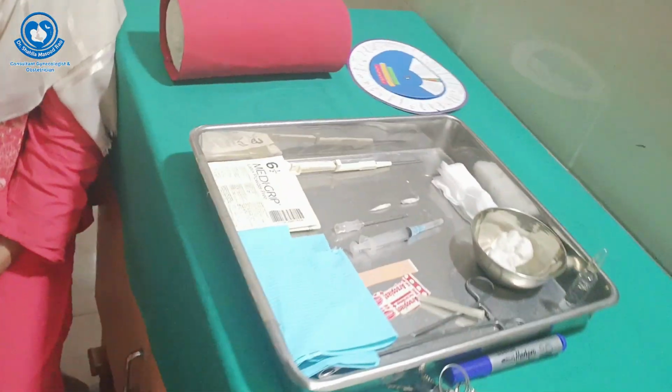Now I'm going to talk about the advantages of the Implanon. Implanon is a safe and cost-effective OPD procedure. There is no need to pay attention on a daily basis, so it doesn't require any daily attention. The most important advantage is that it has an immediate contraceptive effect after insertion, and immediate resumption of fertility after its removal. Systemic side effects are very few. Breastfeeding mothers can also use Implanon or any other implant, and there are fewer hospital visits.